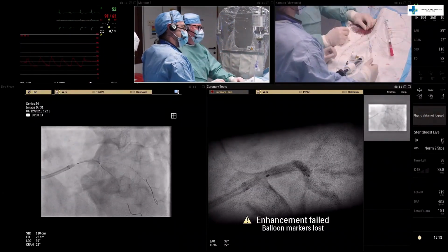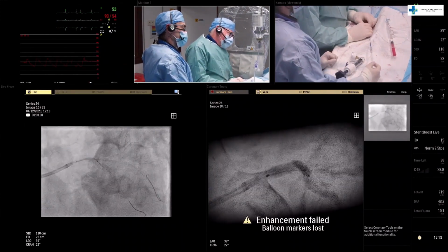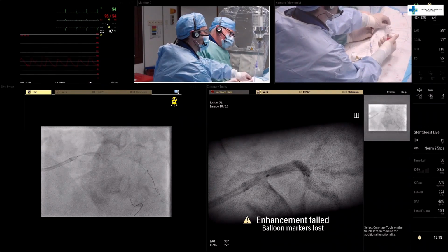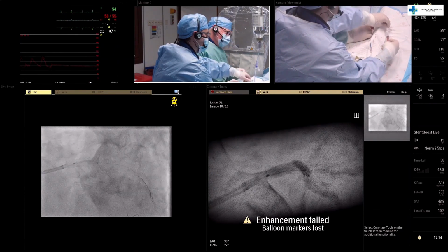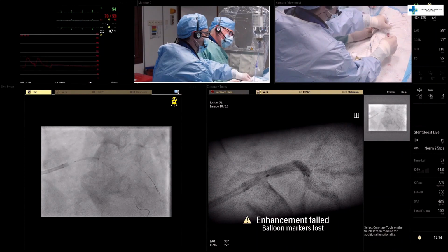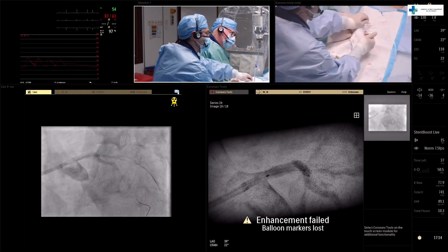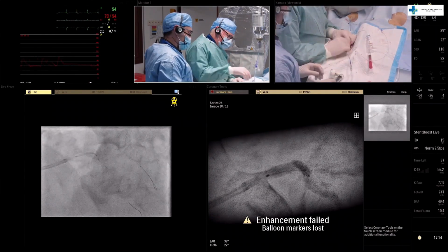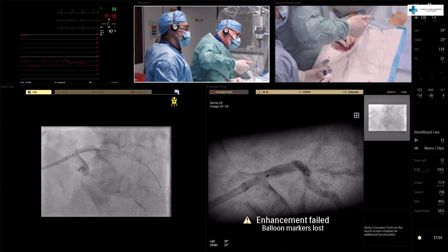And you see, in this projection, it looks like we need more protrusion into the aorta. So I pull back a little bit, and again, now check. And this is probably the best projection to do this. We have some movement of the stent forward and backward, so we have to be very careful. Pavel, what do you think? Perfect position. Okay, so maybe one small injection to confirm, and you can inflate.